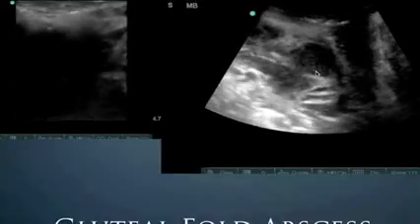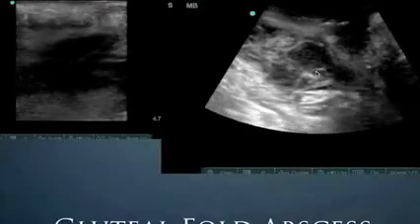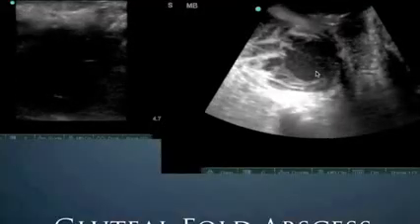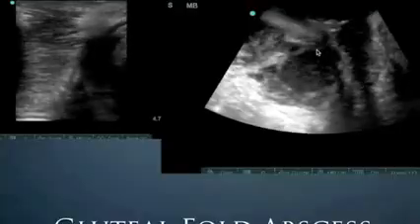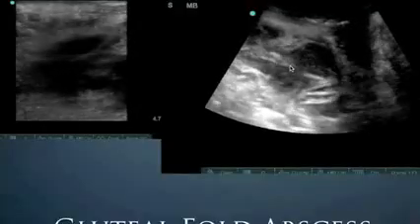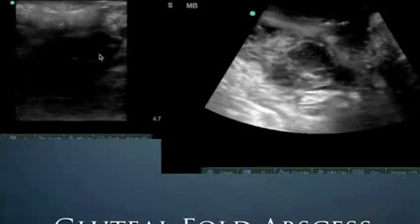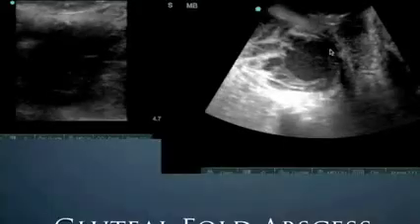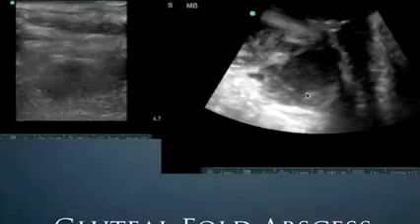There was no overlying erythema. The patient simply complained of pain every time he sits down on his tailbone area, and we weren't thinking much of it because there was no overlying erythema of the skin. However, the guy was very, very tender, so we went ahead and looked first with the linear probe. Couldn't see anything. We moved to the C60 in that gluteal fold. That was the thing to do. We could see this large abscess down here that was later confirmed on CT scan.